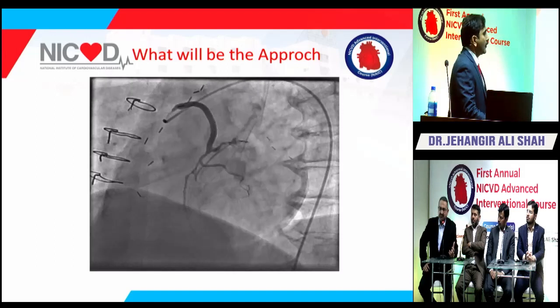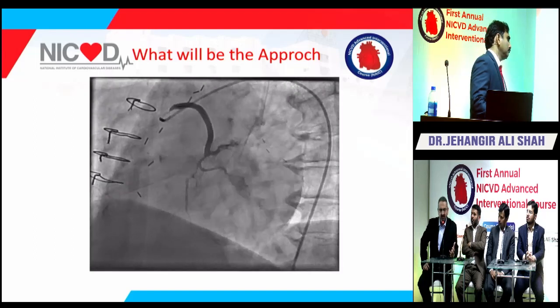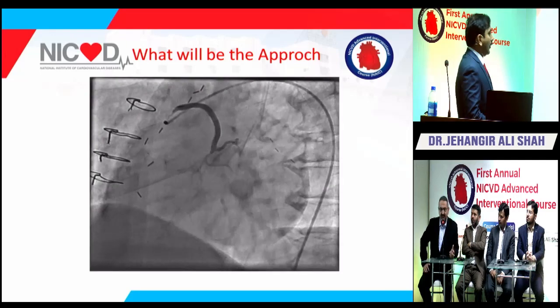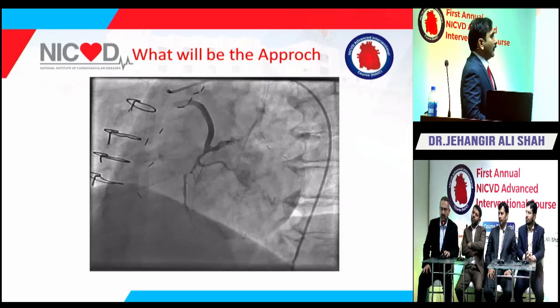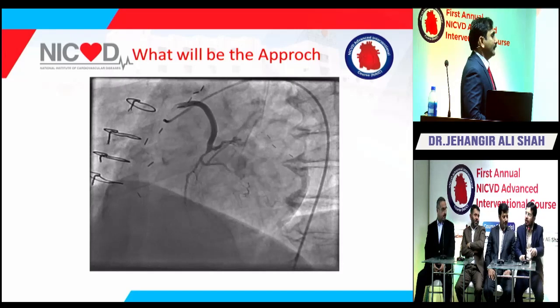Embolic aspiration thrombectomy, yes, if you are not using an embolic protection device and there is a high thrombus burden. Probably in your case you won't be needing that. Is there any? No, I don't think so. What do you think, Dr. Ammar? I agree with Dr. Atif.